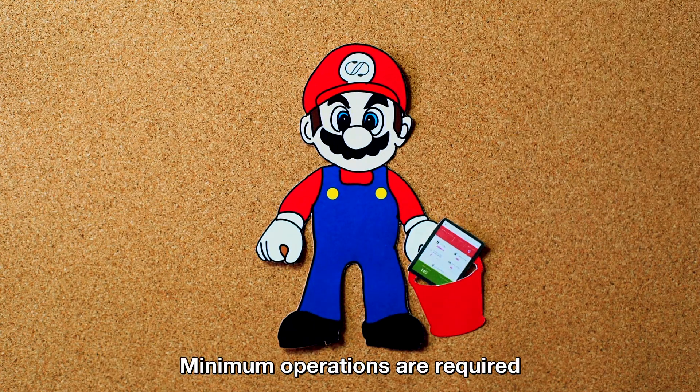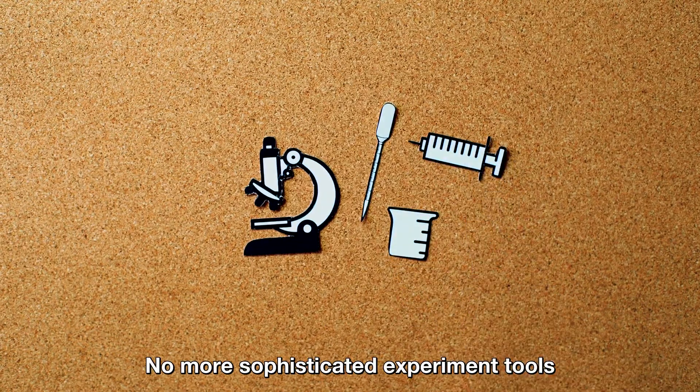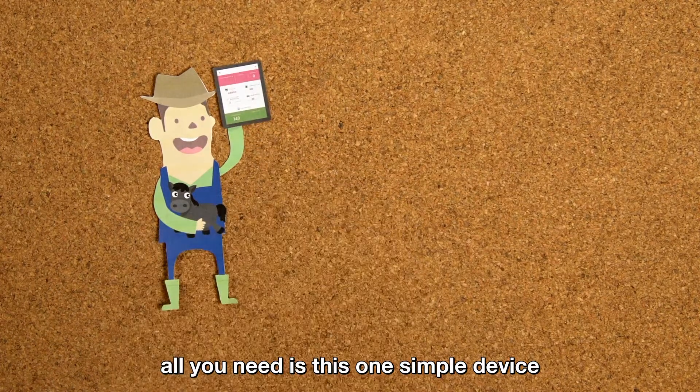Minimum operations are required. No more heavy microscopes. No more sophisticated experiment tools. To enhance breeding efficiency, all you need is this one simple device.